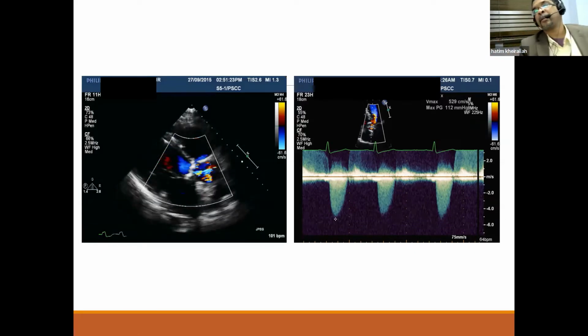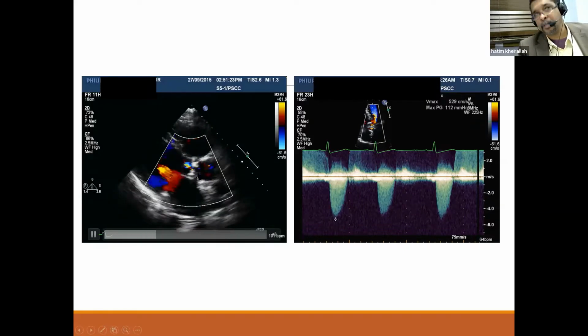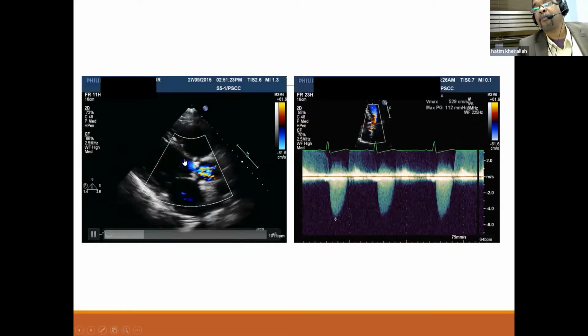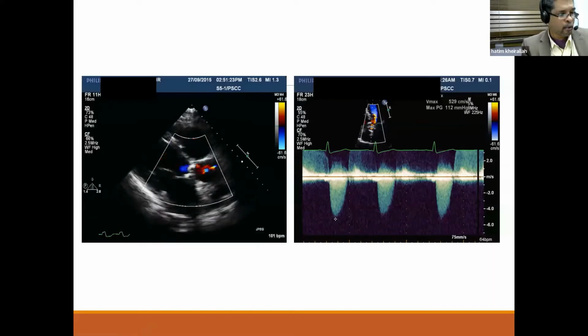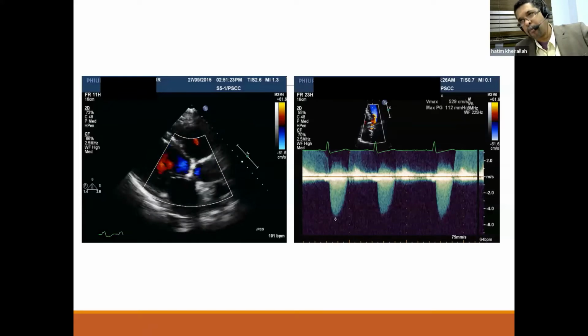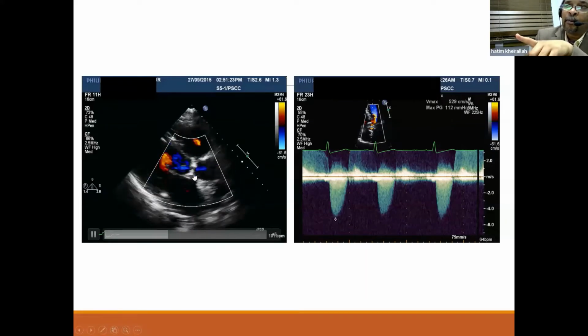Like in this case, we see that the valve is degenerative calcified with reduced excursion, and like Muawiya said, the flow acceleration starts at the valve. And this is really important, by the way, because the obstruction might be supravalvular or subvalvular. So where the flow acceleration starts, what you usually call turbulence, but the right terminology is flow acceleration, not turbulence, okay? The flow acceleration here now starts immediately after the valve, meaning the problem is here.